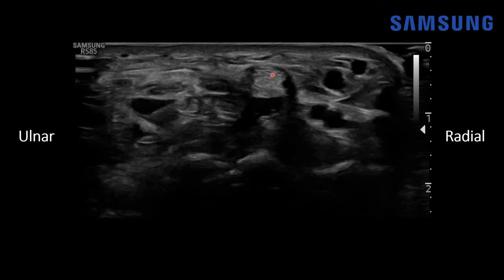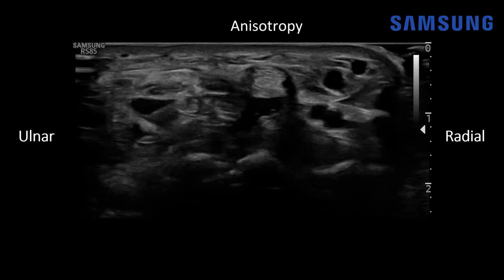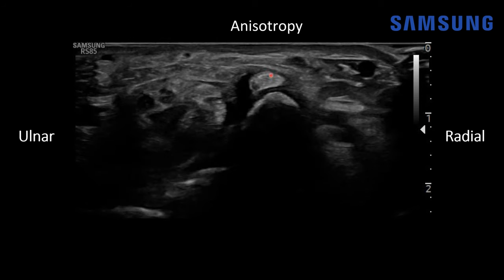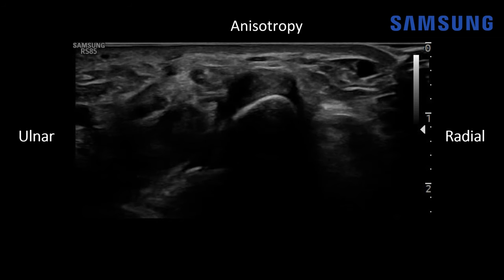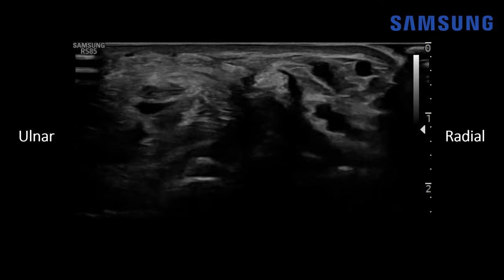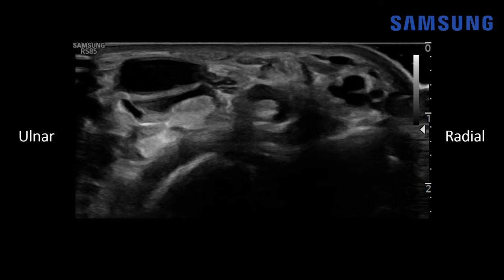The other way you can identify this as a tendon and not a nerve is the phenomenon of anisotropy, which is an artifact we typically only see with tendons. Normally they'll have this bright echogenic compact fibrillar structure when the ultrasound beam is perpendicular to the tendon, but as it dives down and is no longer perpendicular, it becomes hypoechoic. That's a phenomenon we do not see with nerves — they remain having that honeycomb configuration.